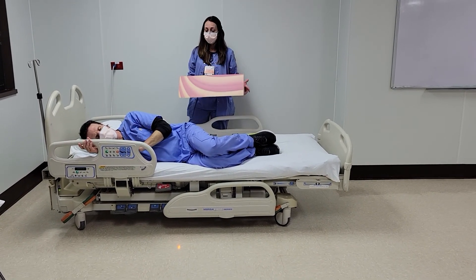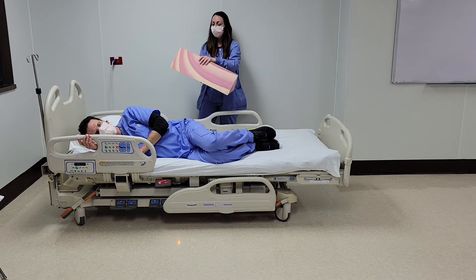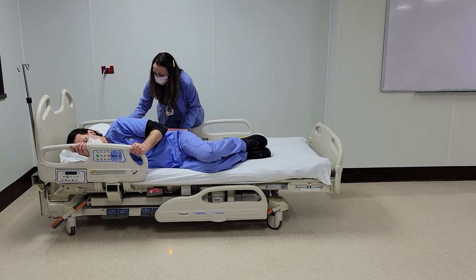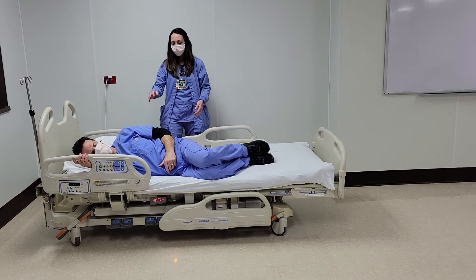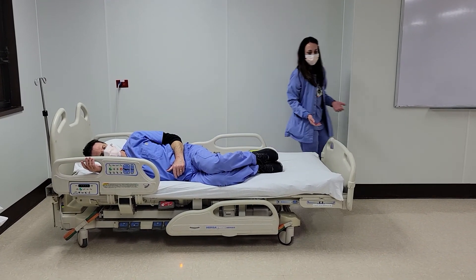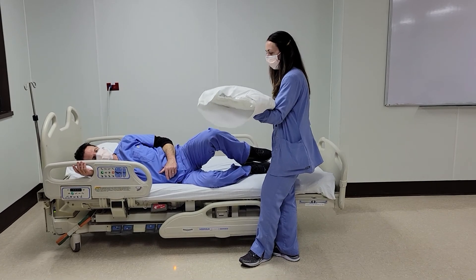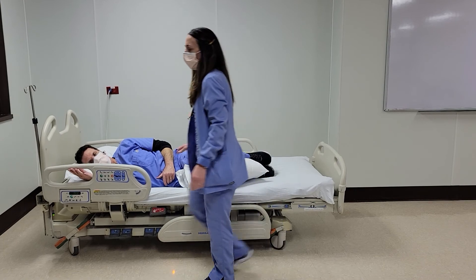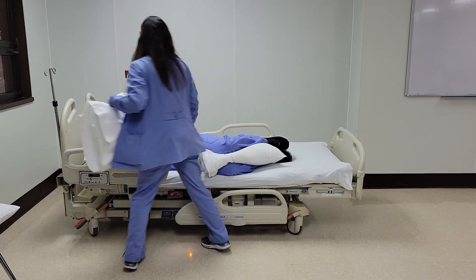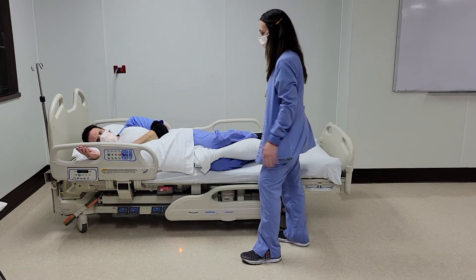As far as the positioner goes: if you're going to do true offloading, you want to use the steeper incline, not the less steep incline. This is very important for true pressure relief offloading. The wedge positioner can be positioned behind the patient from scapula to sacrum — it's going to prevent them from rolling back and ending up on their back. We suggest placing a pillow between the patient's legs lengthwise to keep the hips and ankles in line, and then give the patient a pillow to hug. This helps with shoulder position, especially for a patient who has suffered a stroke or has some weakness — you don't want to leave the arm behind.